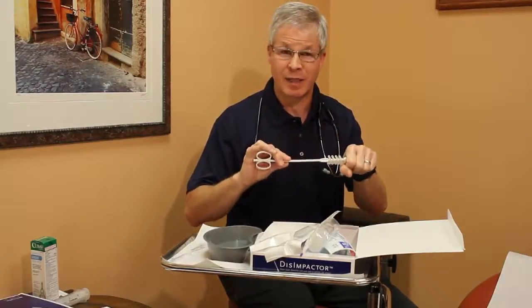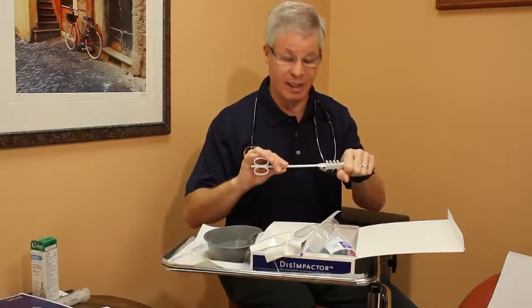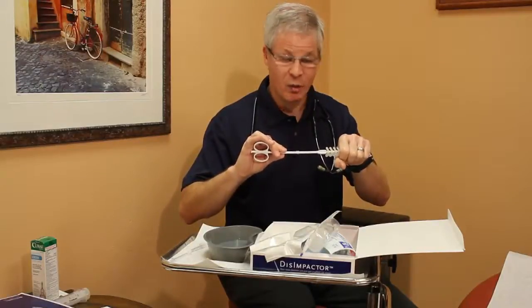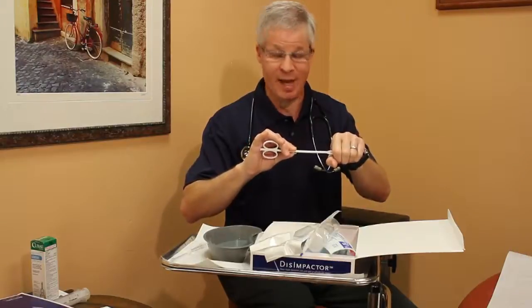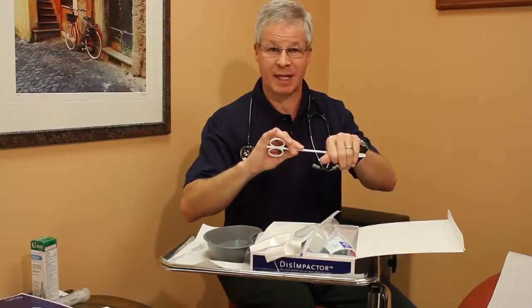It's that slight bearing down that allows them to relax the external anal sphincter and allow the admittance of the device. So as they're just slightly bearing down, we're going to gently insert the device and get the entire head of the device past that second bullet into the rectal vault, past the anus.